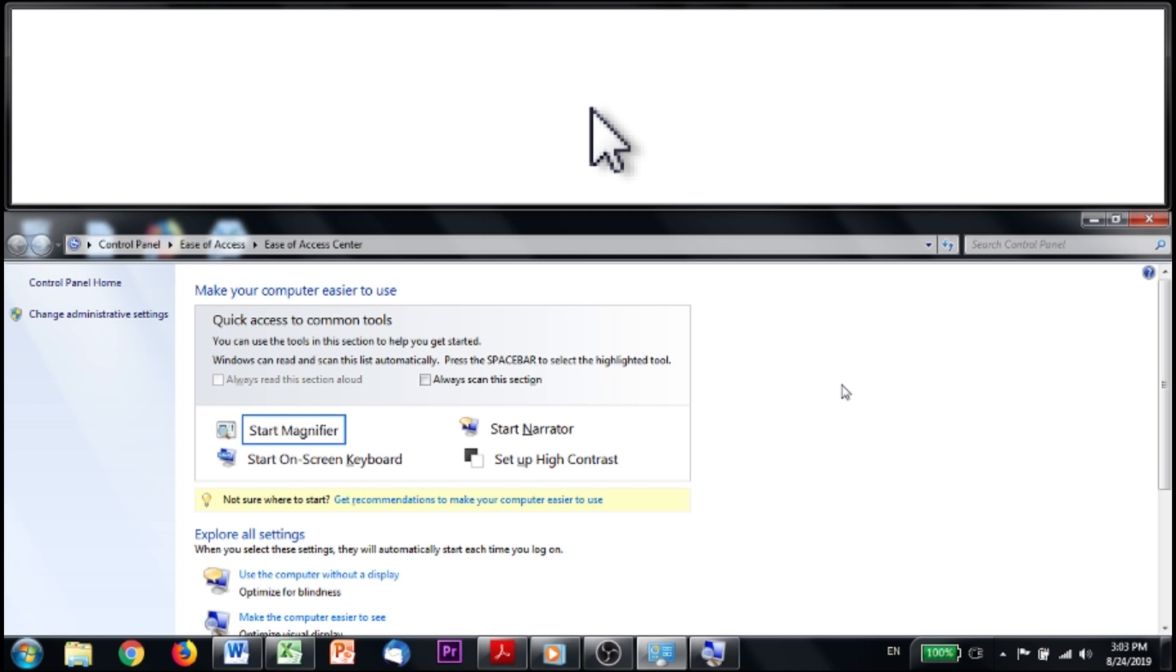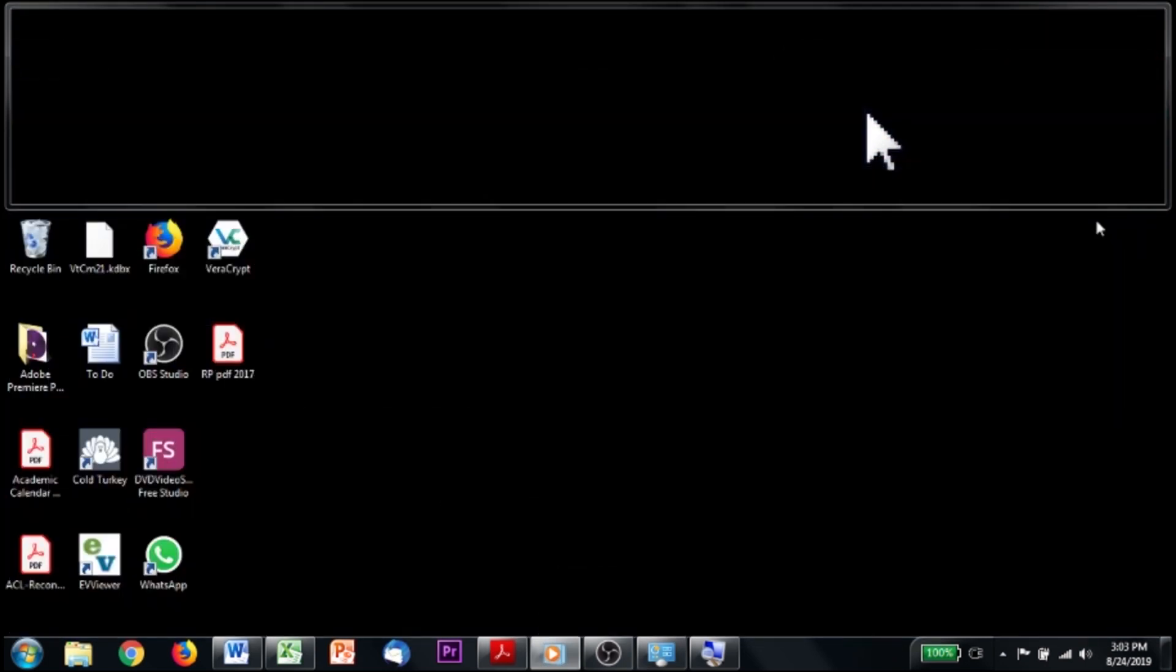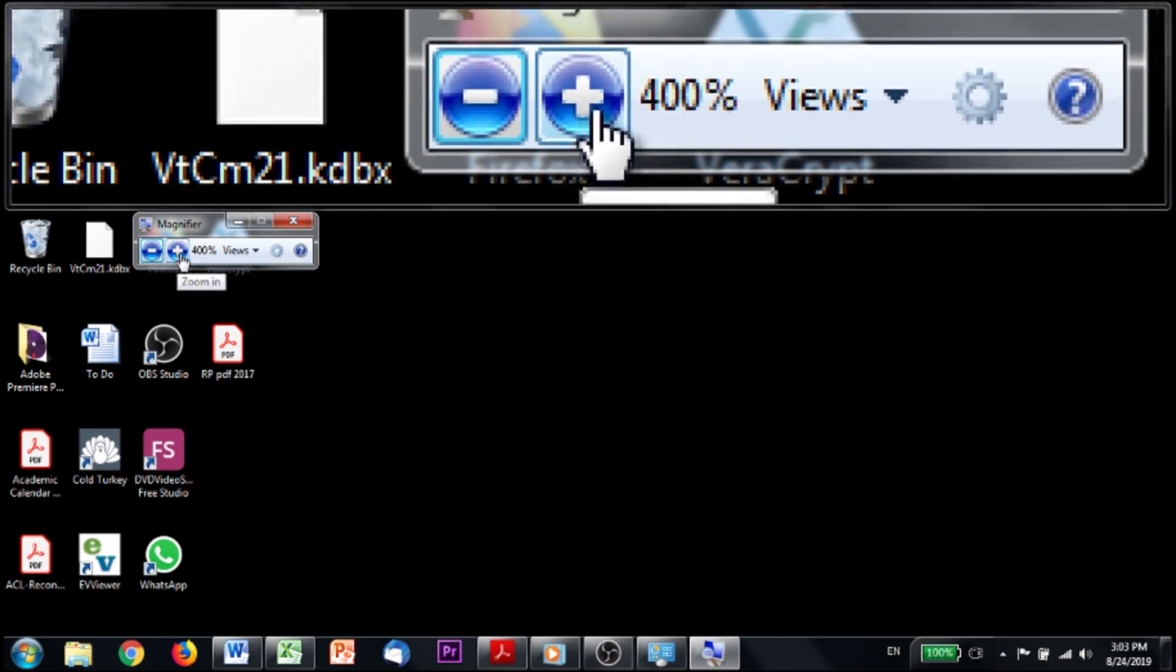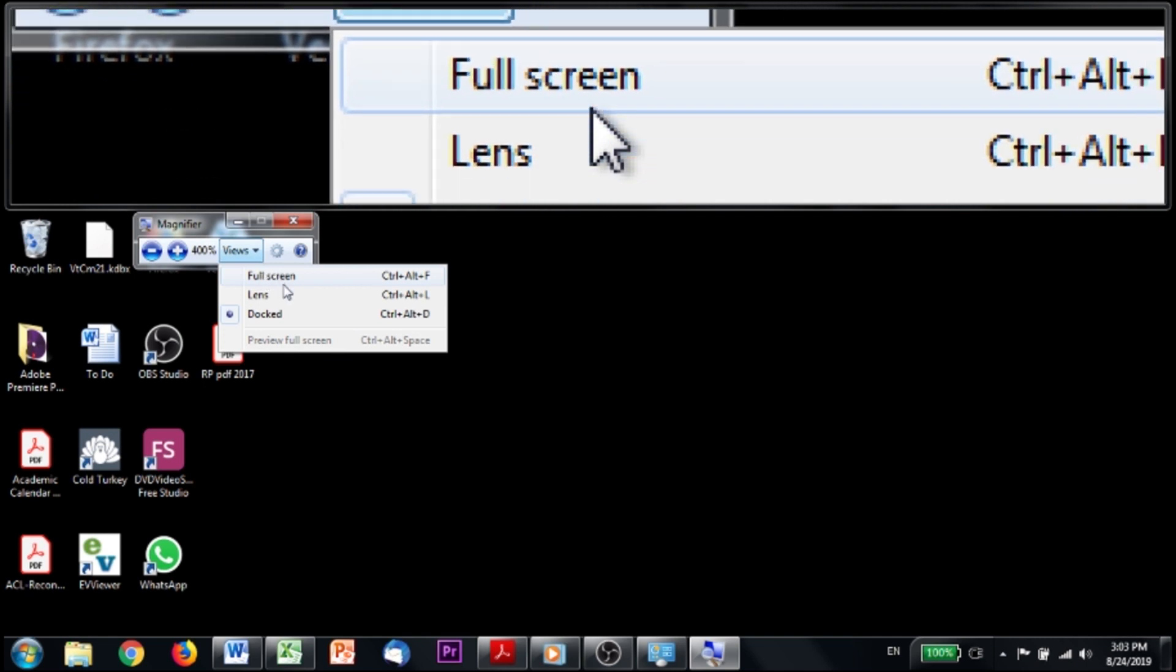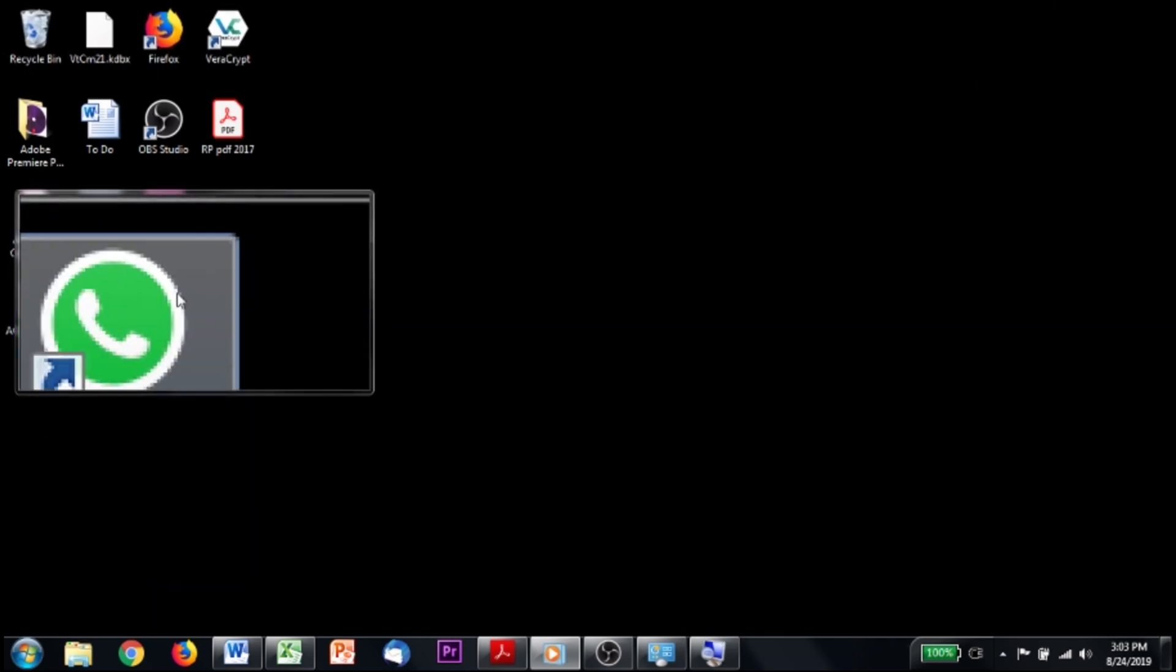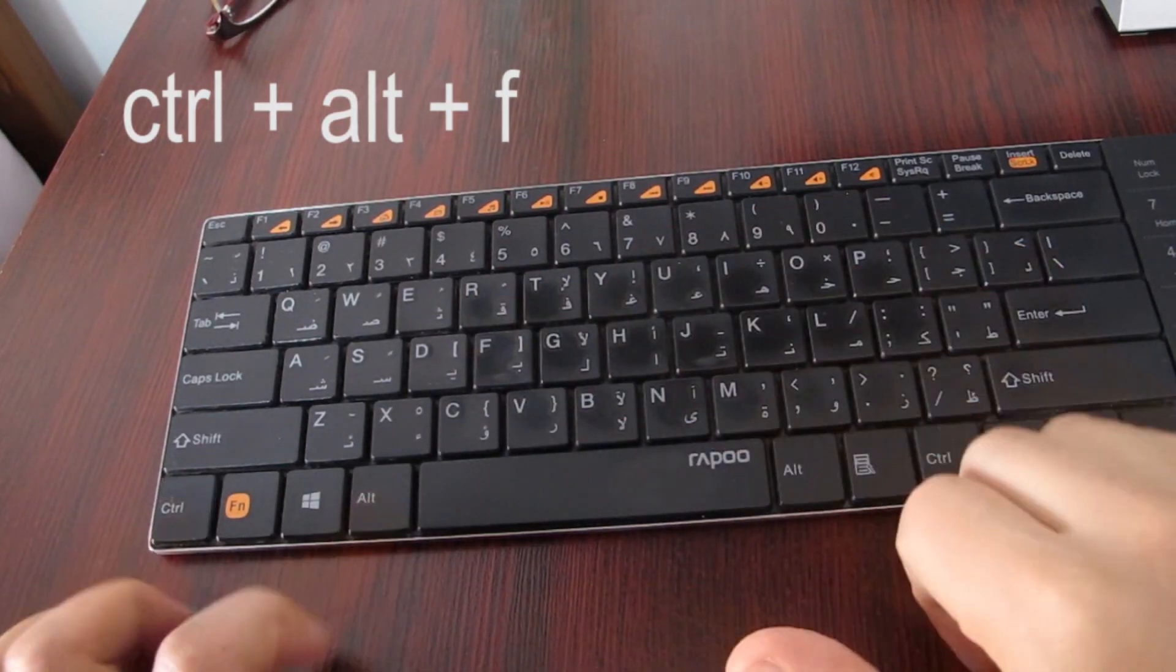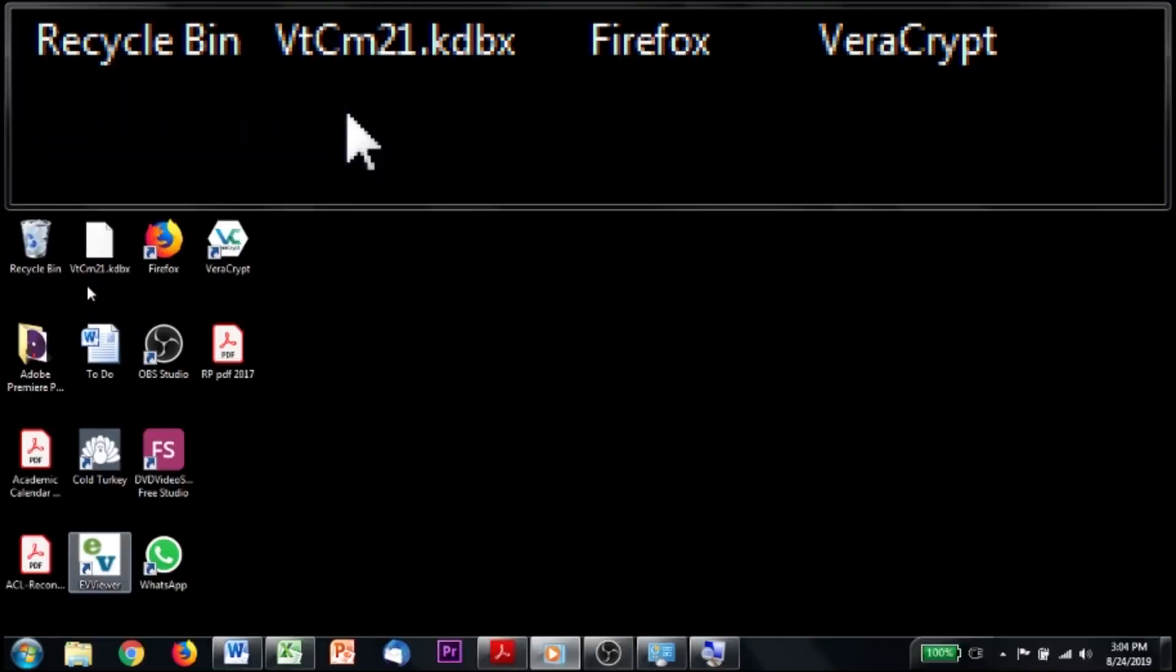But there are also other modes. If you go here, you can also just close the ease of access center. That will not close the magnifier. Here is the magnifier icon on your taskbar. And up here, you see that you can change the magnification or you can change what kind of mode you're in. This is called the docked mode, but there's also a lens mode, which I don't like very much. Or you can flip to the full screen mode by hitting the control, alt, and F buttons. And now you have full screen. I only use this mode when I'm reading. Most of the time, I stick with the docked view.